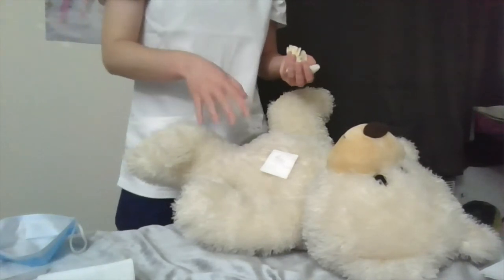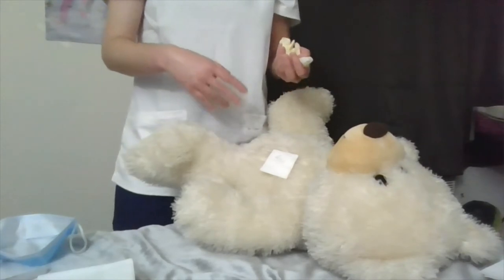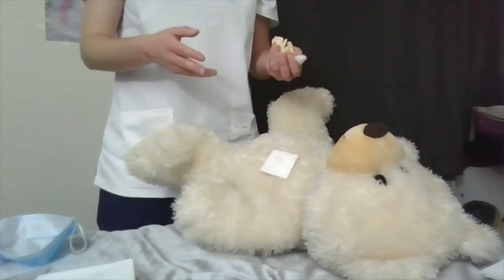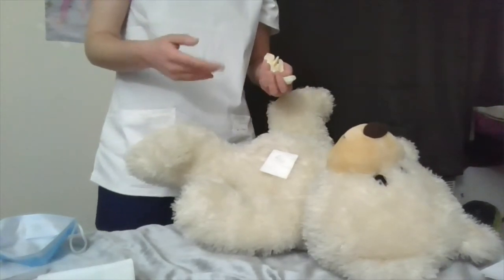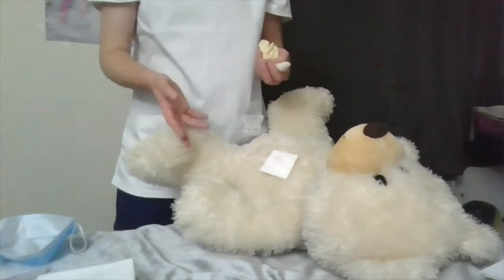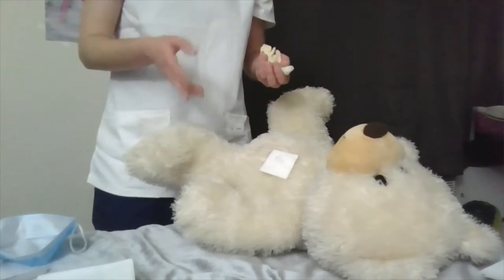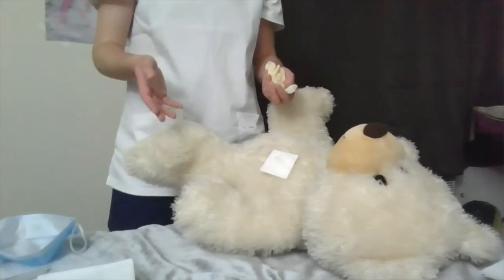When we assess the site of the central line, we're going to be assessing for the condition and appearance. We're going to identify if there's any redness, swelling, tenderness, or any discharge from the site, and if there's any warmth — all of which would be signs of infection.